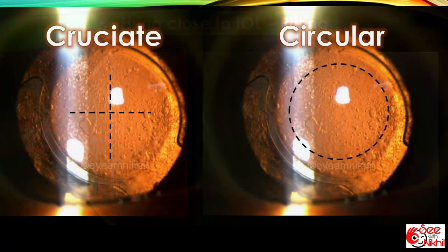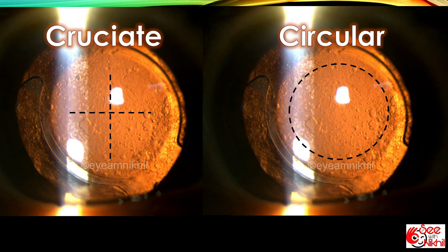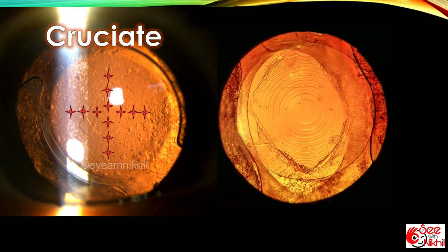There are two primary patterns in which a capsular opening is made: cruciate and circular. In cruciate pattern, laser shots are applied from 12 o'clock to 6 o'clock position, and then towards 3 and 9 o'clock position. This is how the opening looks like upon completion.